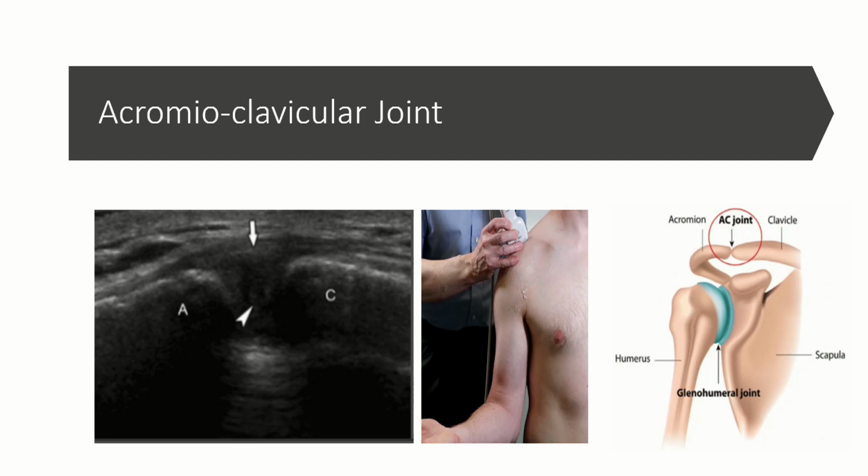But using the ultrasound machine will definitely help to assess whether it is really the supraspinatus or just the AC joint. The acromioclavicular joint looks like an edge with a hypoechoic area, and this is also a very good spot to scan for an intraarticular injection of the AC joint. You will see if there are any osteophytes, so that will let you know definitely that this patient mainly has acromioclavicular joint osteoarthritis.